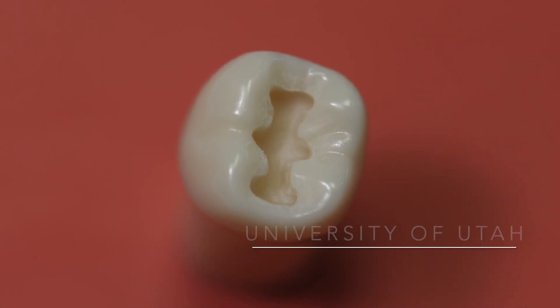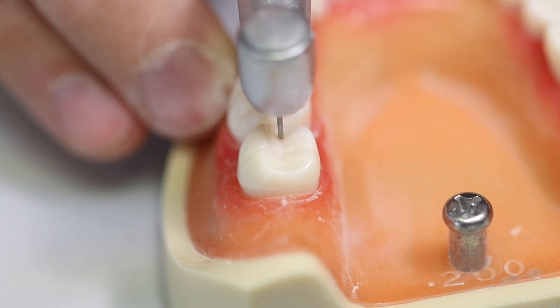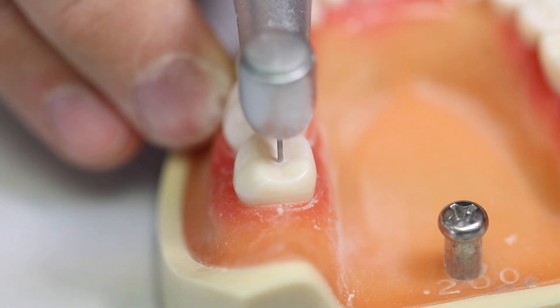The preparation of tooth number 18 for an occlusal amalgam restoration. Using a high-speed handpiece with a modified pen grasp and a 245 burr, begin your preparation by following the central groove.